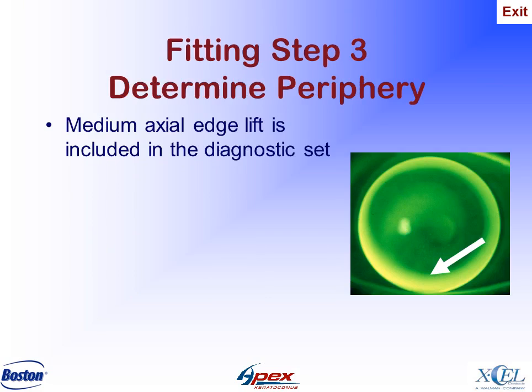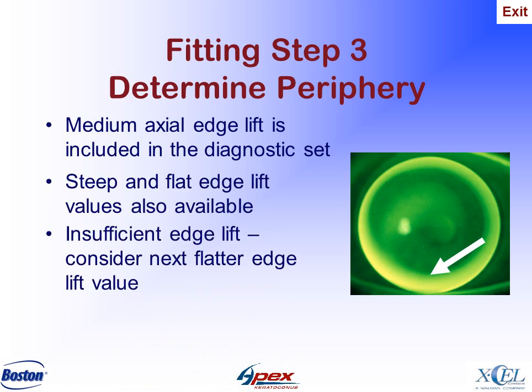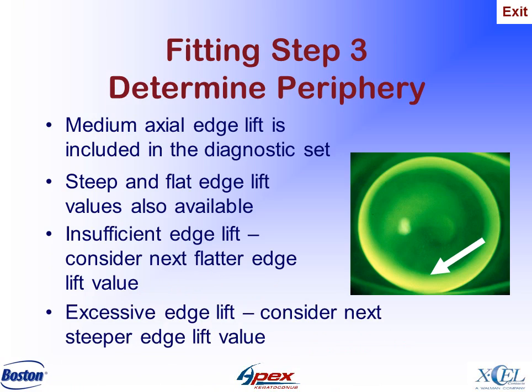The Apex design comes with a standard medium axial edge lift, which is included in the diagnostic set. Steep and flat edge lift values are also available in rarer circumstances where they are indicated. If there is insufficient edge lift, order a lens with the flat edge lift value. Conversely, if excessive edge lift is observed, order the steep edge lift value.